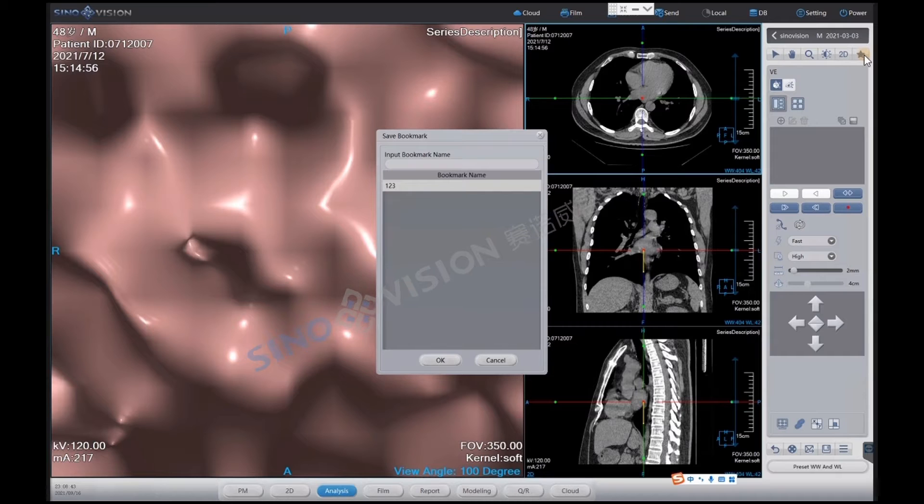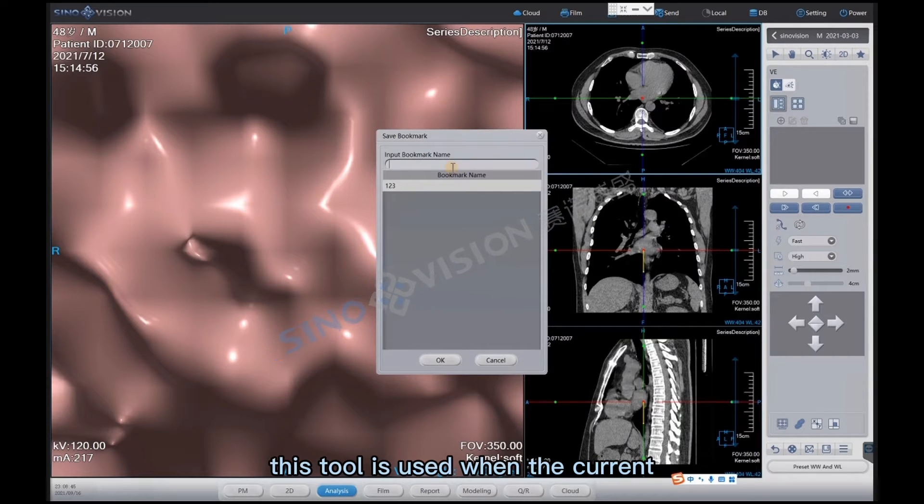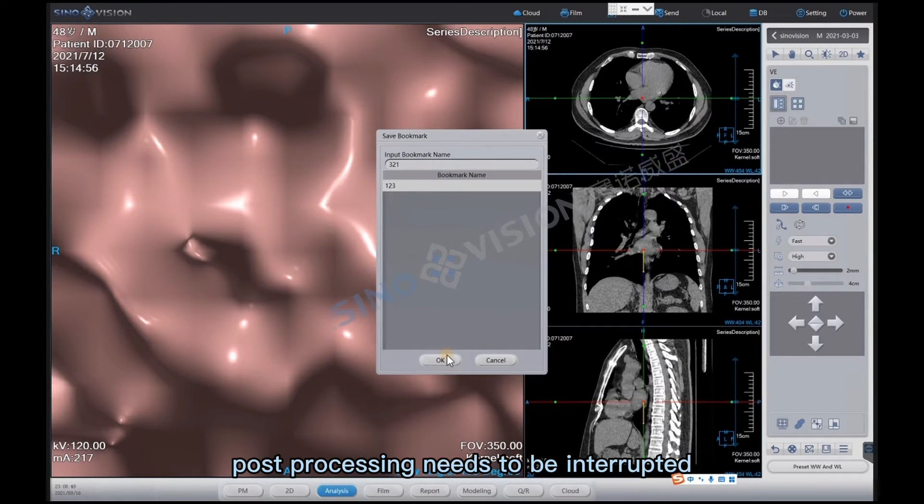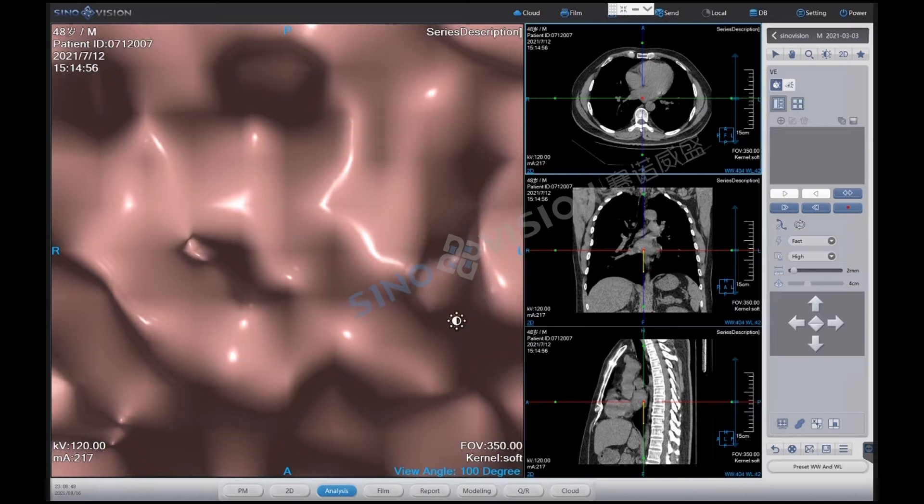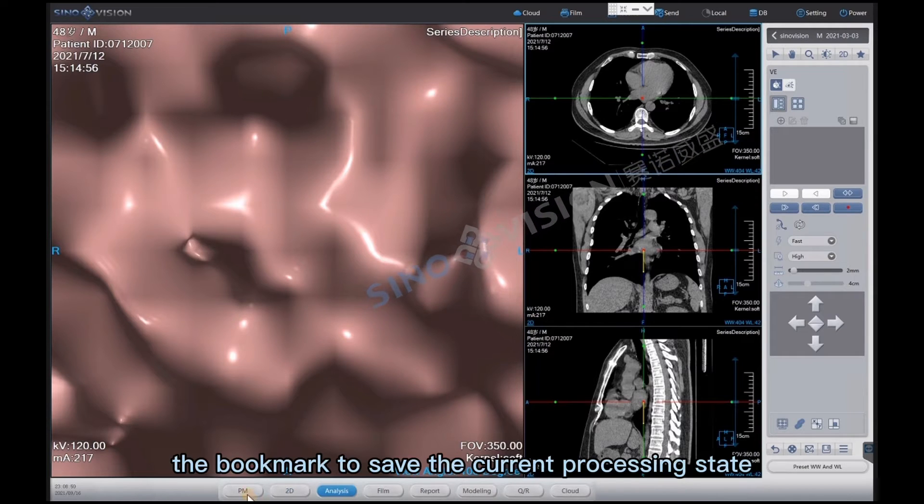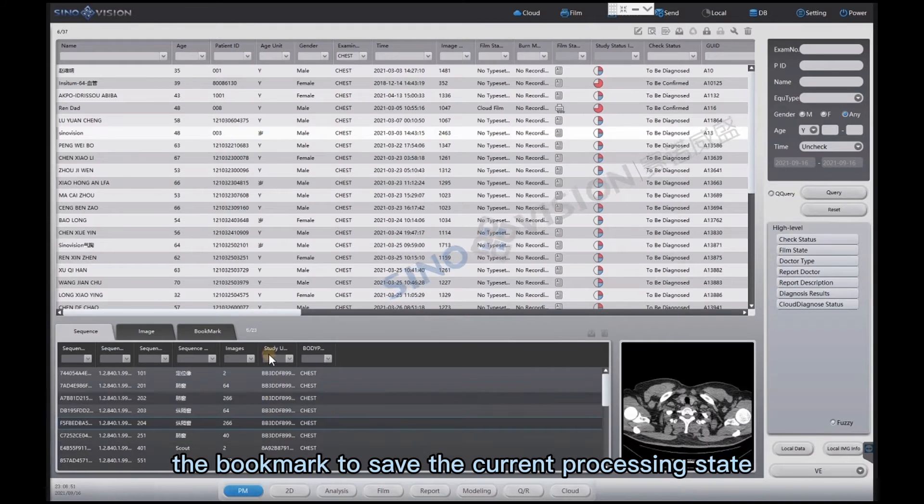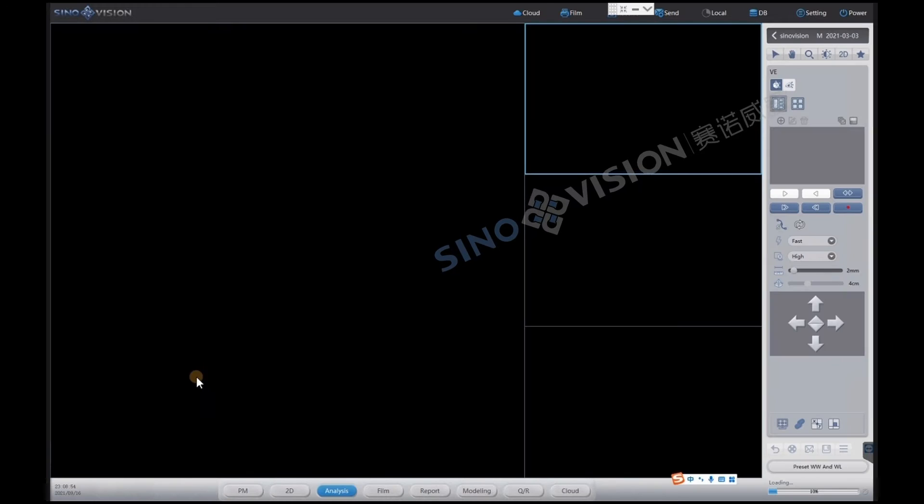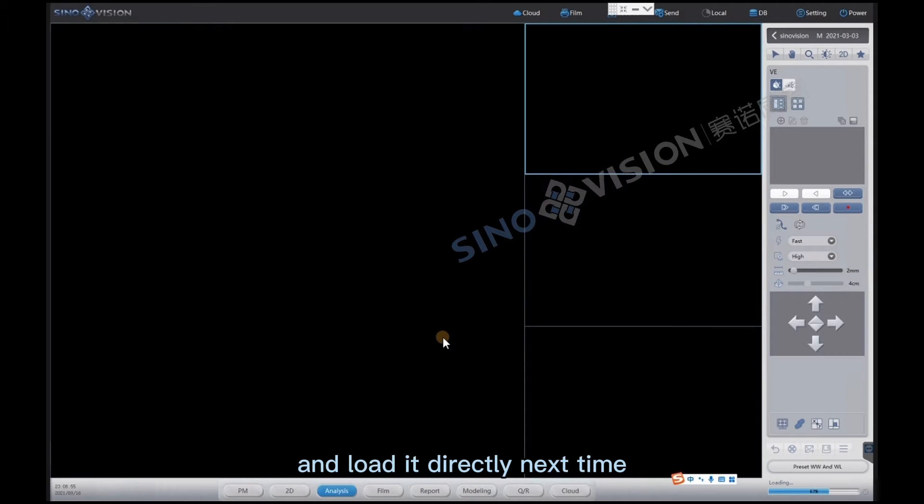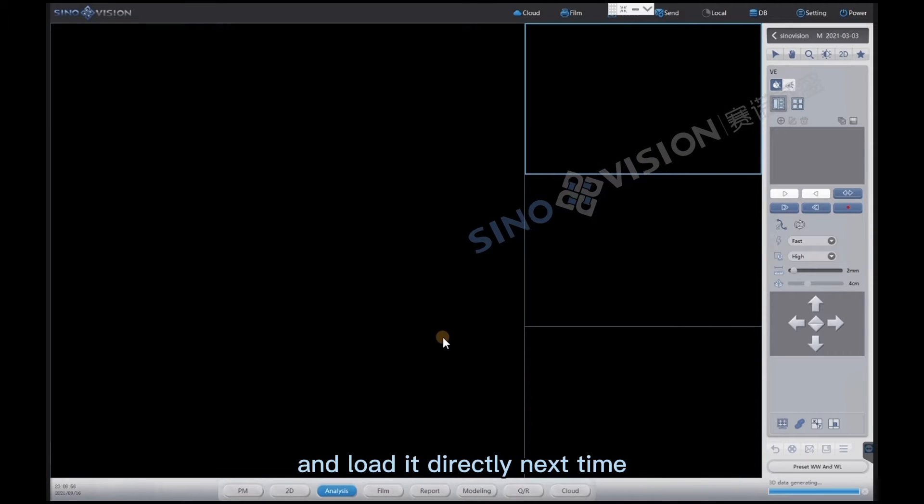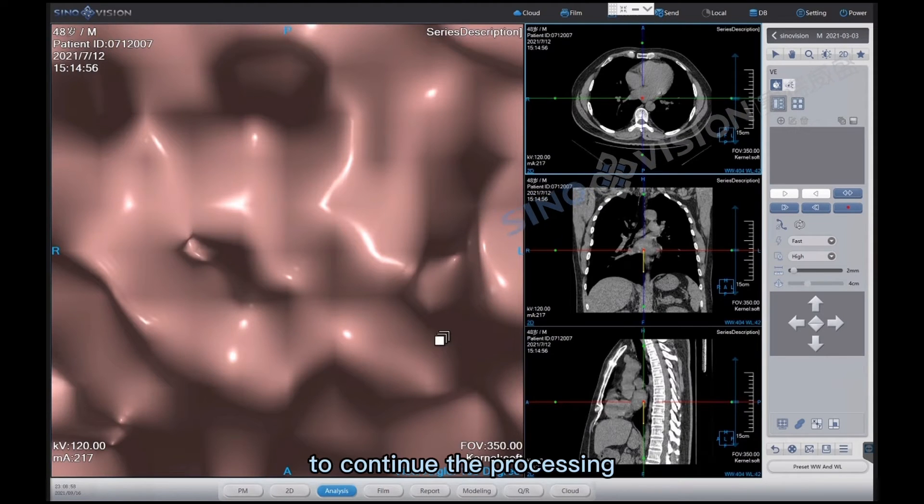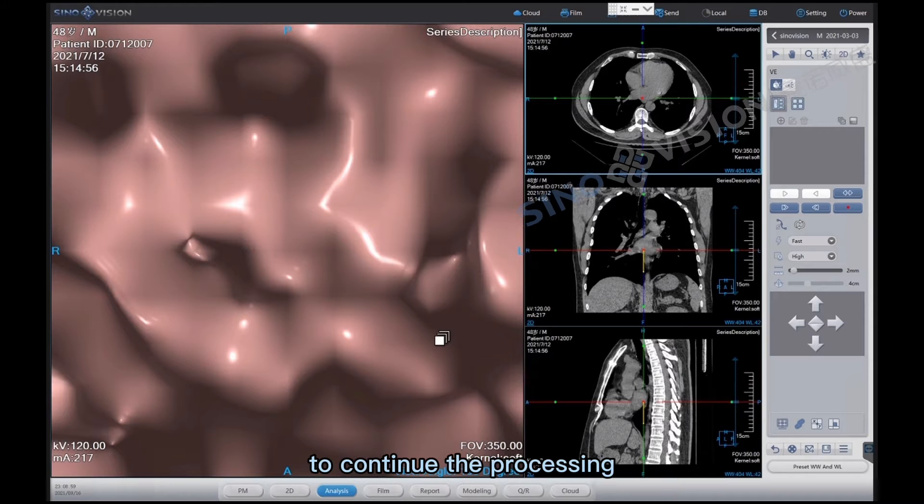Bookmark. This tool is used when the current post-processing needs to be interrupted. We can use the bookmark to save the current processing state and load it directly next time to continue the processing.